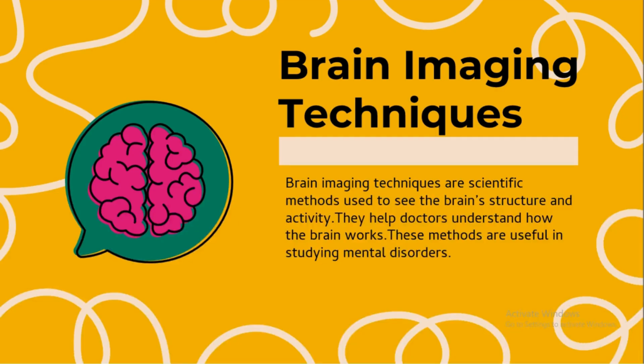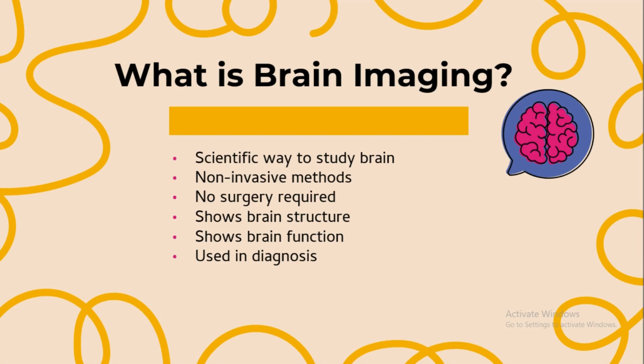Firstly, we describe the brain imaging technique, which we call the BIT. Brain imaging techniques are scientific methods used to see the brain structure and activity. They help doctors to understand how the brain works. These methods are useful in studying mental disorders.